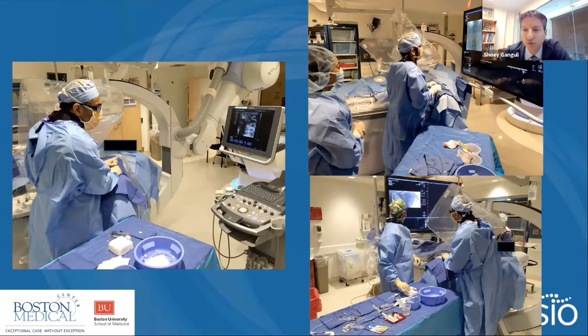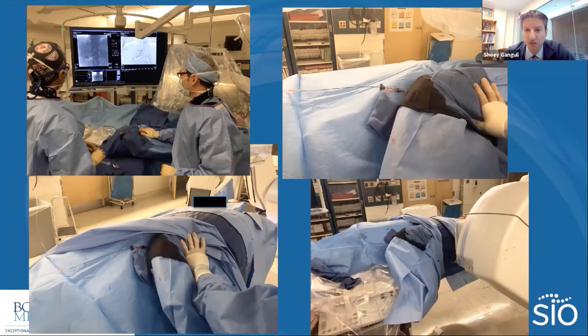So this is about my practice now: I start the procedure with the arm out. We're using the left arm, and of course we don't go across all the great vessels. I do all my mesenteric angiograms with the arm out. And then when I want to get into the liver, this is where I need to do cone beam CT, I bring the arm in. If the person's small, you can just bring it to the side, and the cone beam arc will be fine. Or you can put it up on the patient. I'll use a strap and secure it. And I have no problem doing microcatheter work in the liver with the arm in this position. You can give your Y90, your MAA, and distribution. You have no problem with cone beam.